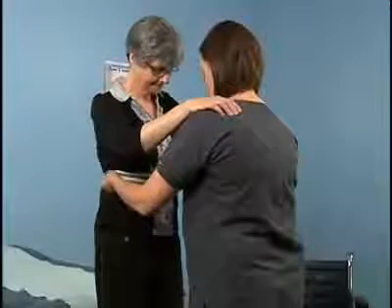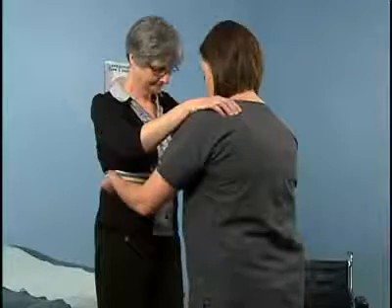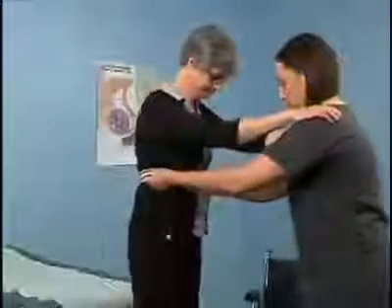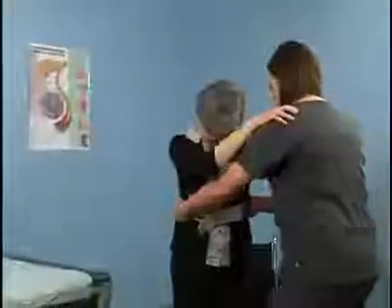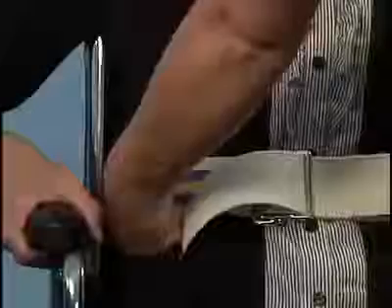Straighten your knees and assist the patient to stand by pulling upwards on the transfer belt. Instruct the patient to step down from the footrest, 1 foot at a time. Pivot the patient until the back of the legs are against the seat of the wheelchair. Bend your knees and gradually lower the patient into the wheelchair with the buttocks at the back of the chair.